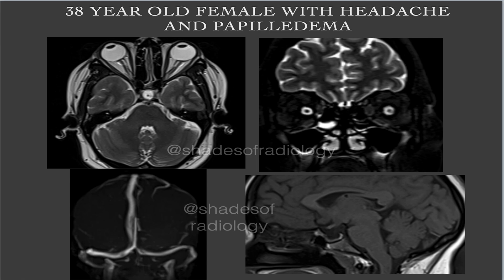This is the axial T2-weighted MR image at the level of orbits. This is the coronal T2 fat-sat image of orbits, this is the MR venogram, and this is a sagittal T1-weighted image. You can pause the video for a while, have a look at the findings, and come to a conclusion based on the findings.